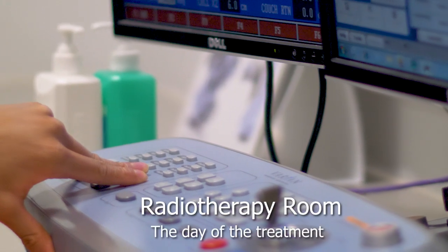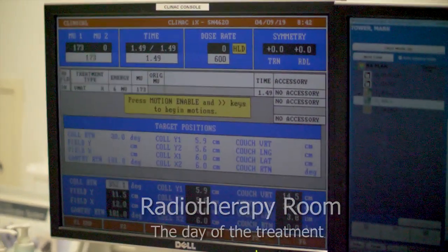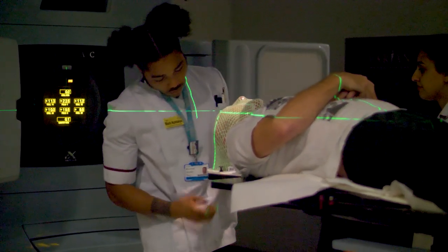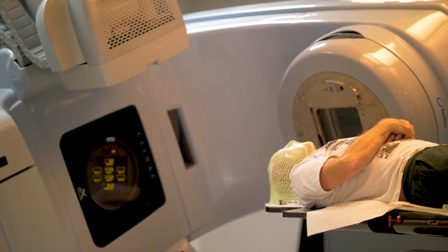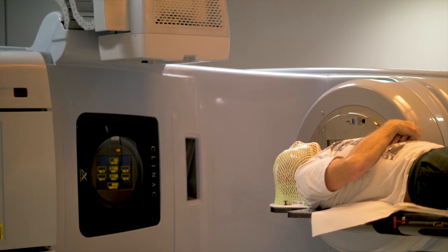Now we're back to see the actual radiotherapy treatment session, which can last anything from between 10 to 30 minutes. At Barts Hospital a linac, or medical linear accelerator, is used, and this customises high energy x-rays or electrons to attack the tumour's specific shape and destroy the cancer cells while sparing the surrounding normal brain.